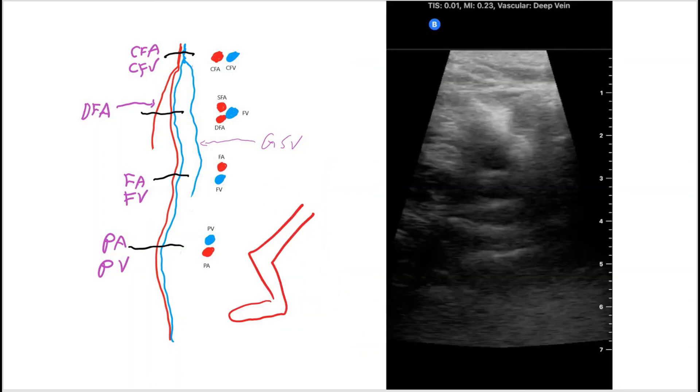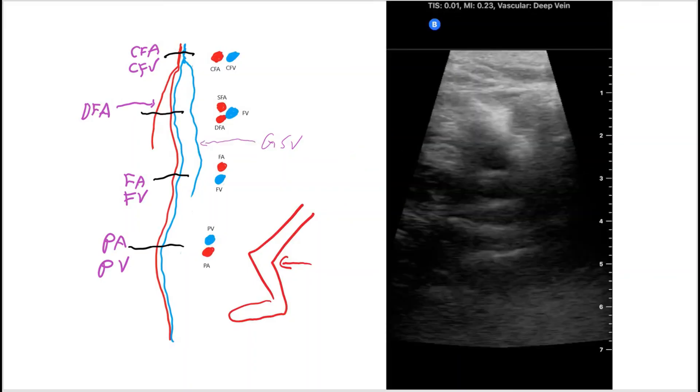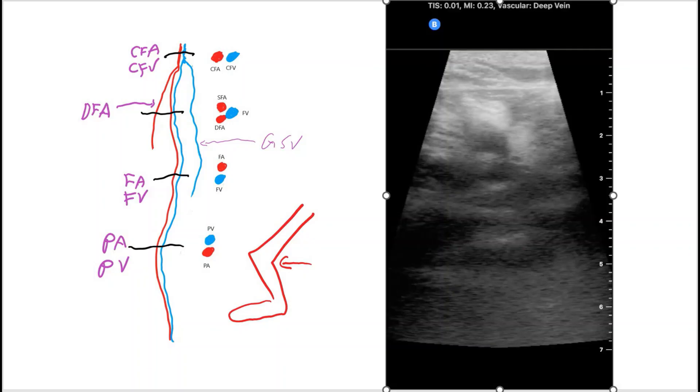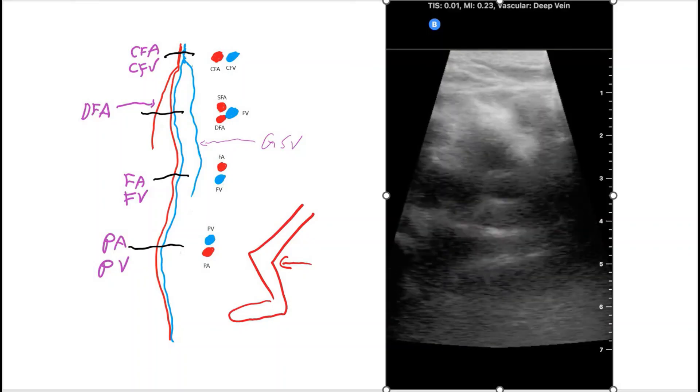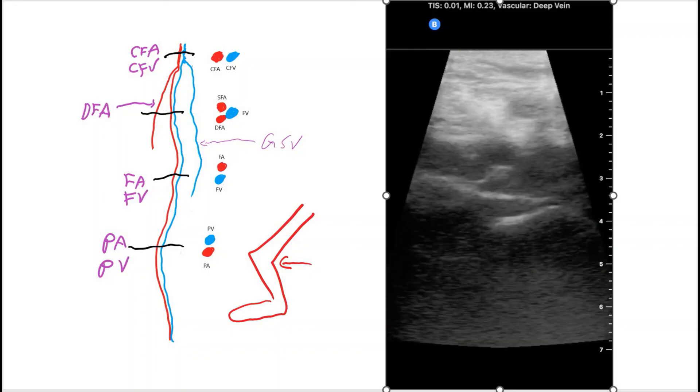To look at the popliteal vessels the ultrasound points behind the knee and the indicator now points to the patient's left. And the popliteal vein should be on top and the popliteal artery should be on the bottom of the screen. Here we will show you a video. So here you can see that the popliteal artery is pulsating on the bottom and the popliteal vein collapses when you compress.